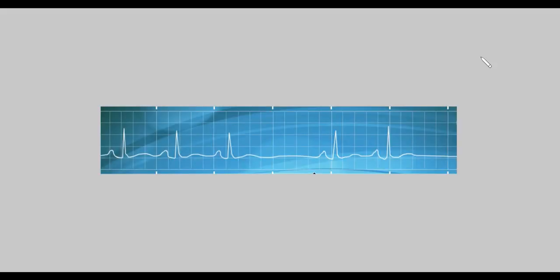Okay, so when we look at this rhythm, we're not really sure what's going on. We're like, okay, we're going to the fridge, and yes, we'll get ice cream. Pause. Do we need that ice cream? Yes, we'll get some ice cream.